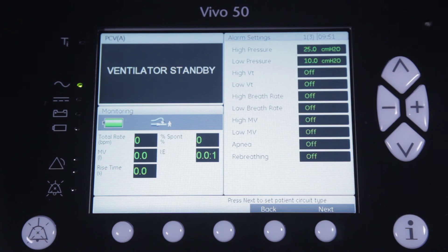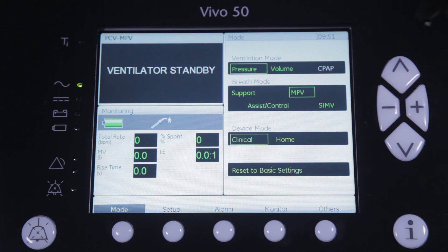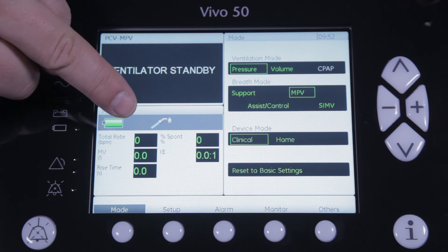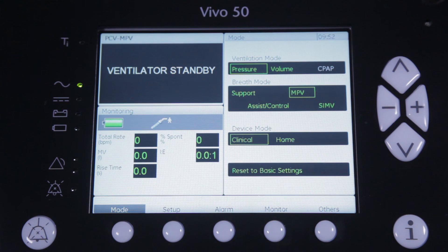All we have to do now is press next and the Vivo is ready to be used in pressure controlled MPV. As you can see, the ventilator shows PCV MPV as the ventilation mode and has changed the icon of the circuit type to a circuit with an angled mouthpiece as used during MPV.